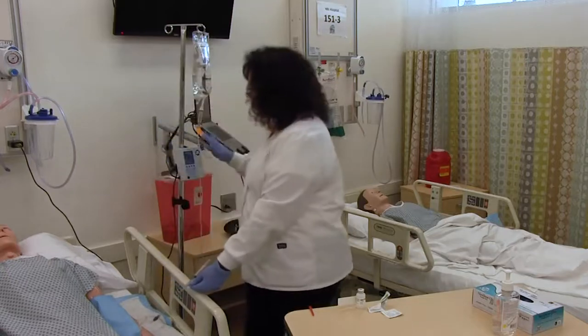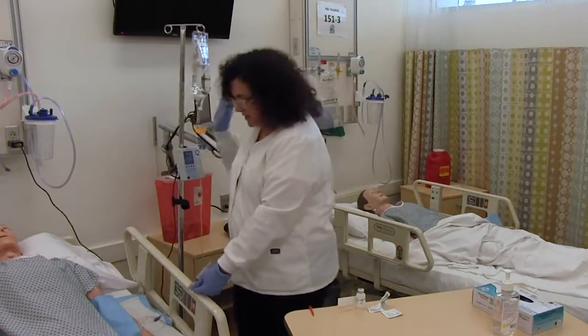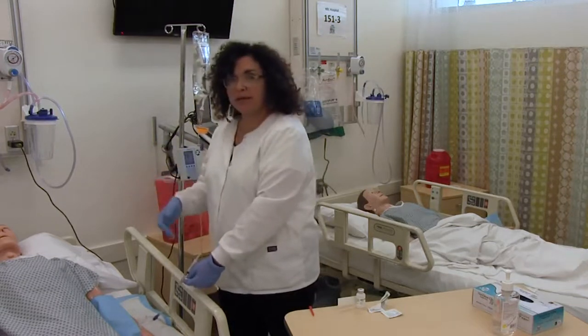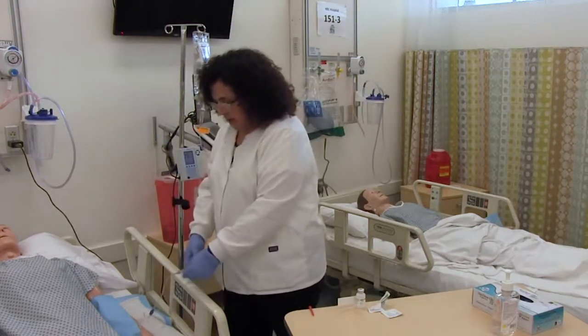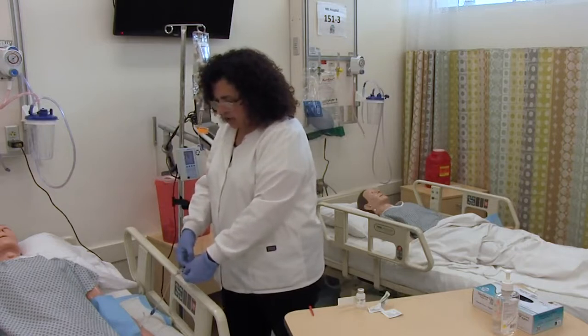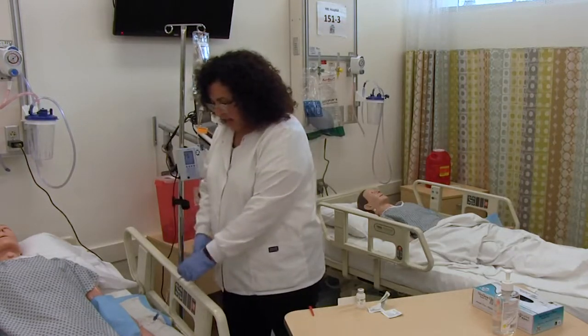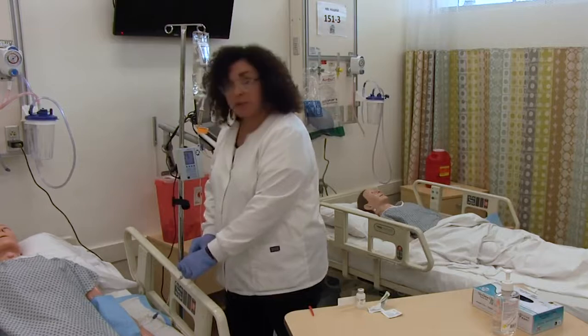We don't want to turn the pump off. We want it to be running again so the flow is transporting the medication into the bloodstream. But we do begin by pinching the tubing just above the Y site, and we begin by aspirating.